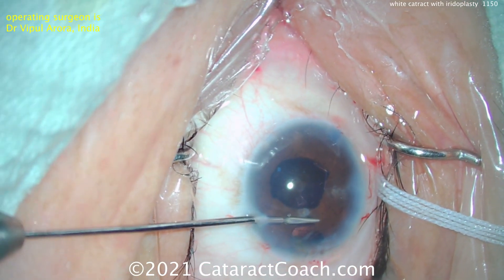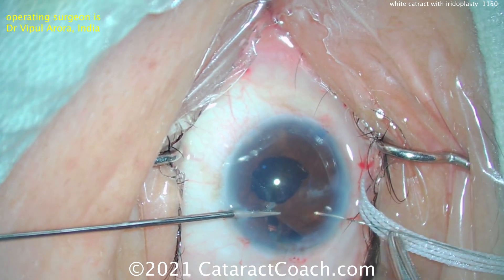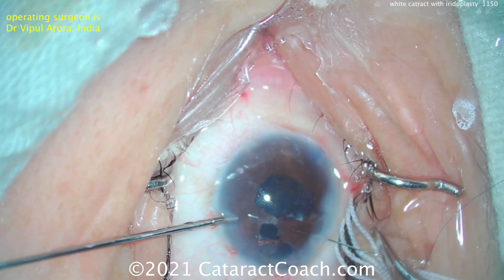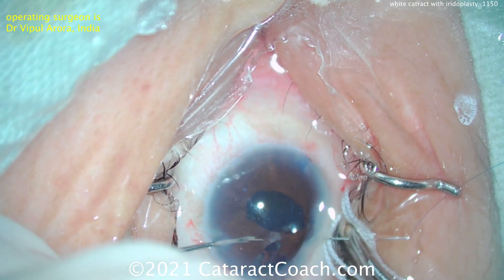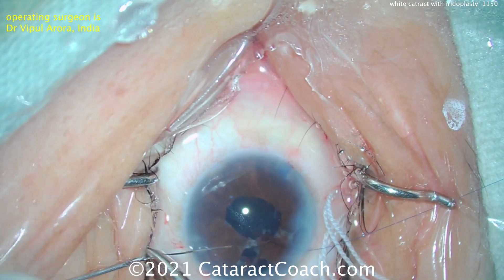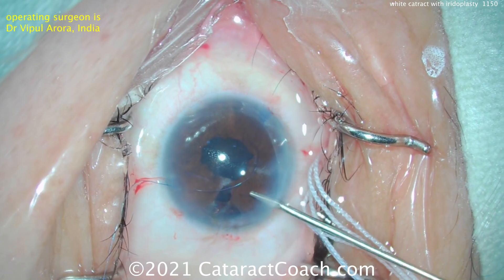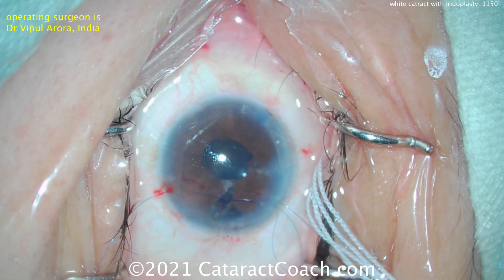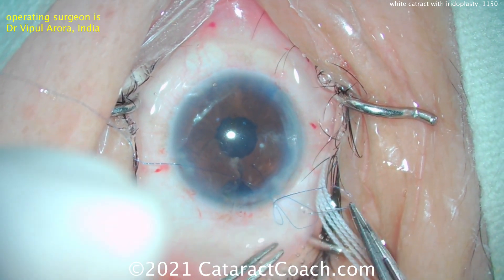And now here comes the pupilloplasty. Using micro forceps to grab. You notice Dr. Arora has changed his seating position, and now passing what looks like a 10-0 prolene on a long needle, then docking it into that hollow bore needle and pulling it out through the paracentesis. And then you can do this pupilloplasty, just tying a couple of sutures — a few interrupted sutures ought to do it. After this first suture goes down, he's using the micro forceps. This looks like a four-throw pupilloplasty.